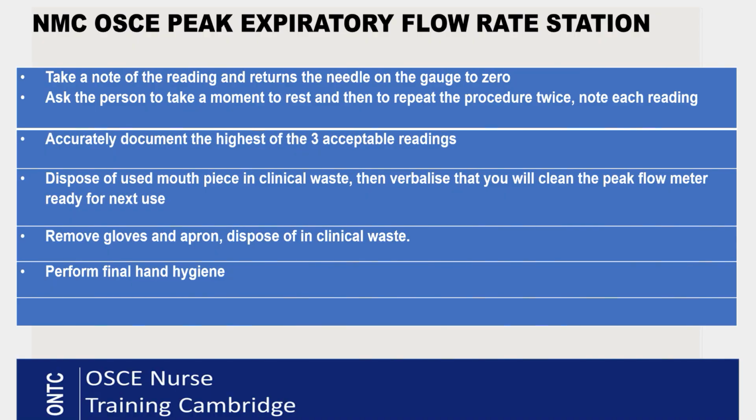Then you're going to repeat the procedure another 2 times. So second time again, make sure you bring the needle on the gauge back to 0 again. Give your patient a few seconds to just rest. And then you're going to say the same thing again.